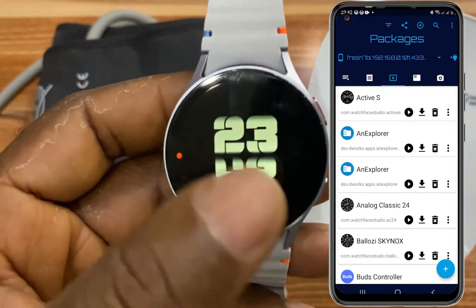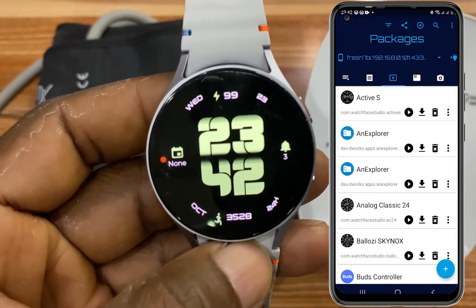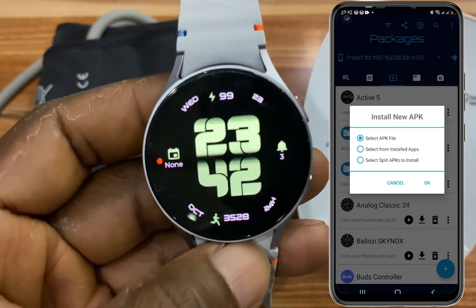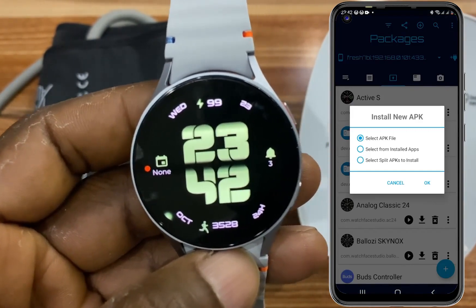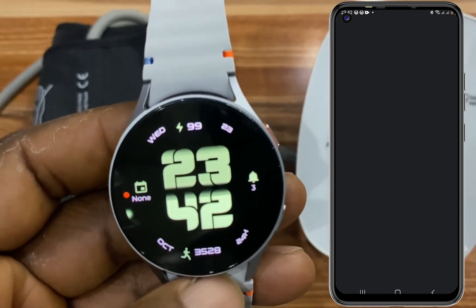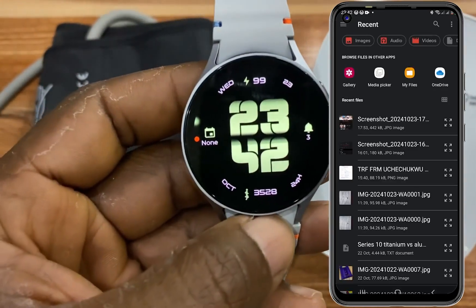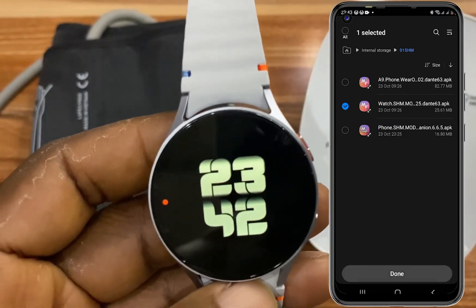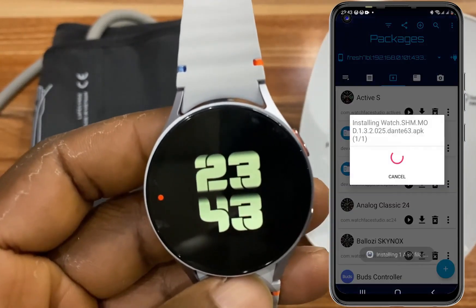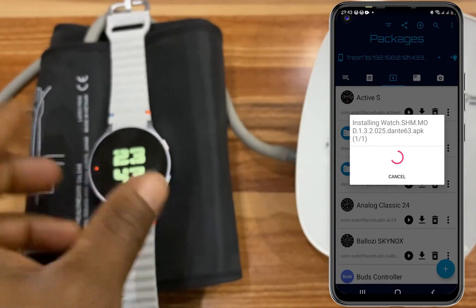This shows that the connection was successful. To install the app, simply tap on the plus icon at the bottom of the screen and tap on OK. Select the app APK file. Tap on OK and locate where you have saved the SHM app for watch that you downloaded initially. Go ahead and select that and tap on done, and BugJogger will remotely install the SHM app on the watch.